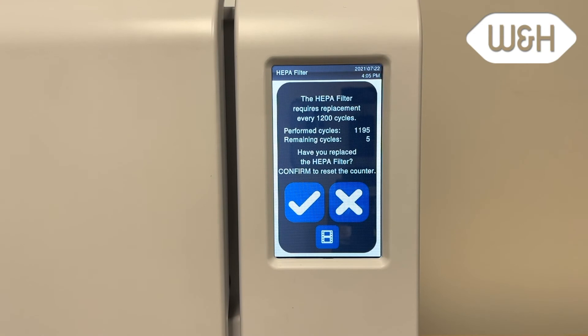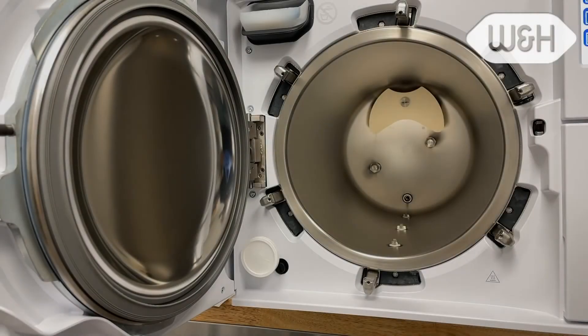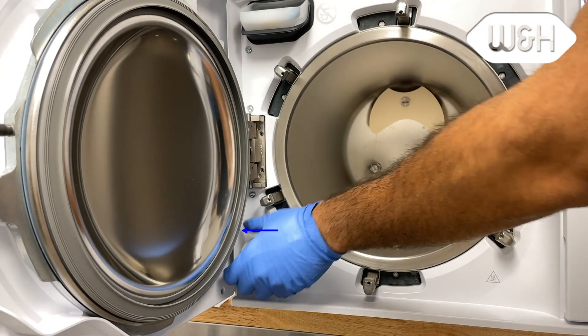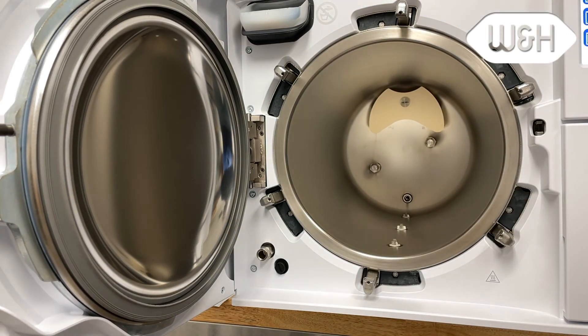Please note, it's important to replace consumables in time when the related message appears to avoid sterilizer malfunction. Replace the HEPA filter by unscrewing the filter counterclockwise. Replace with the new filter and screw clockwise until snug.